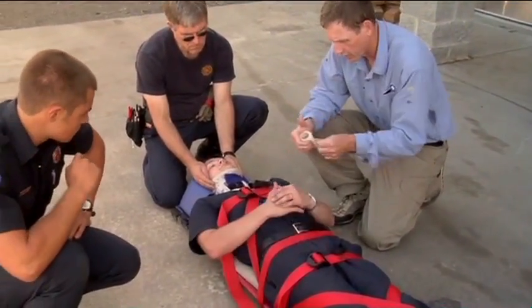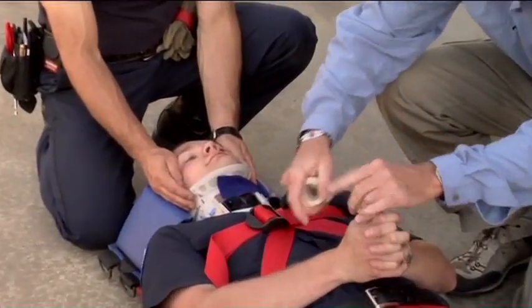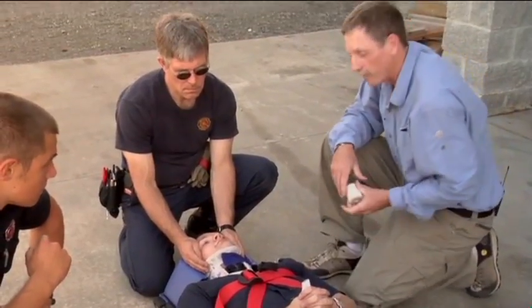Go ahead and tighten your, just give me some thumbs. There, now the patient can still gesture at us, he can still scratch his nose, but he can't try and climb out and drive the ambulance.